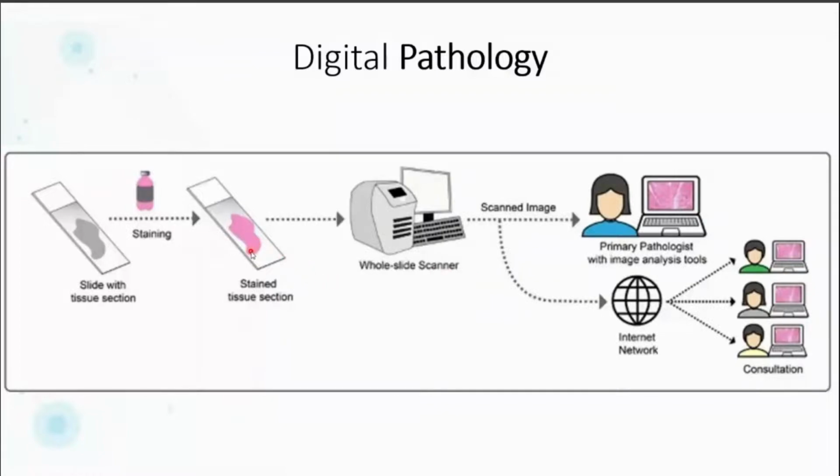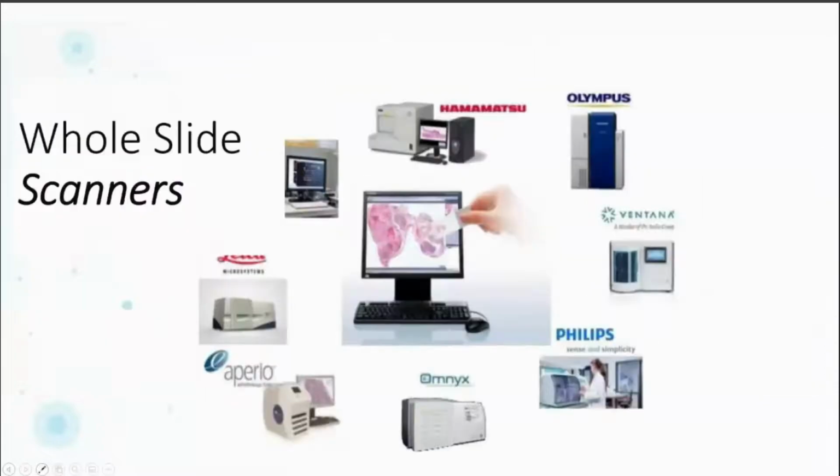We're showing here a traditional 1x3 standard slide, but there are all different dimensions of slides for mounting whole brain resections, prostate resections. So the size of the slide varies, and therefore there are a number of scanners as well that can take different size slides.